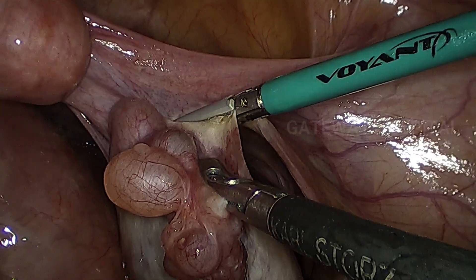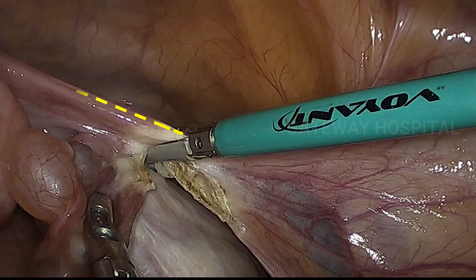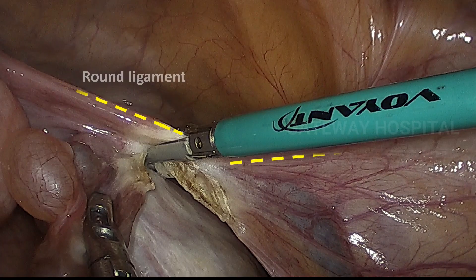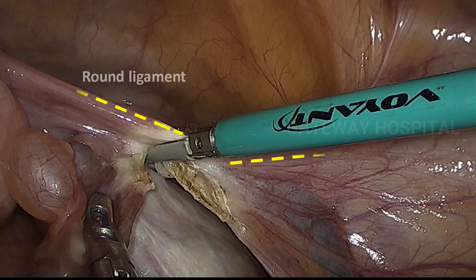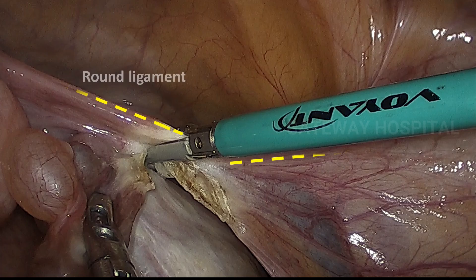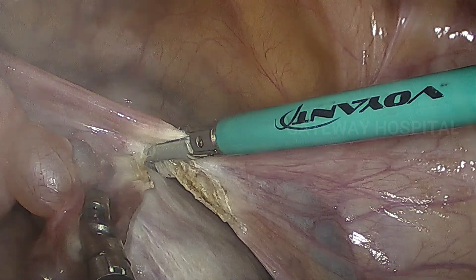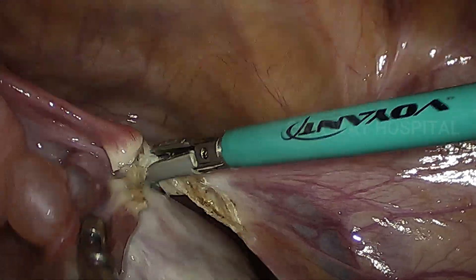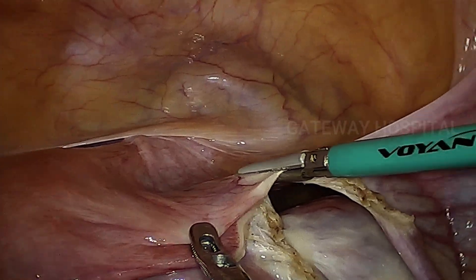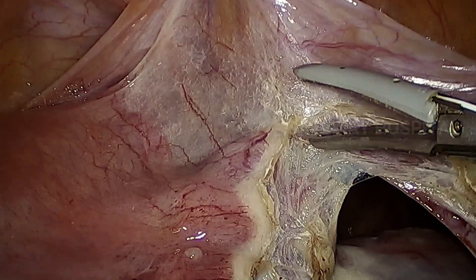You can see the round ligament is being sealed and divided by using the energy source, and we are further going down on the broad ligament.